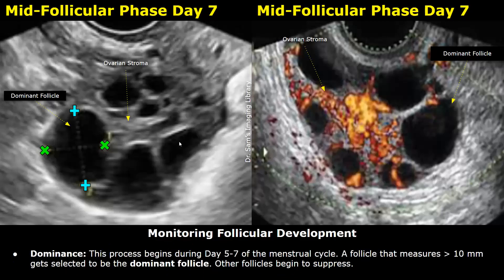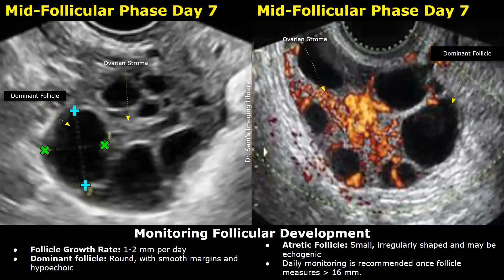During days five to seven, the process of dominance begins. At this stage, the follicle that measures greater than 10 millimeters gets selected to be the dominant follicle. You will start to notice one larger follicle — the one most likely to become dominant. However, sometimes a follicle that appears largest during days three to seven may not always become the dominant follicle, as another follicle can quickly start growing later on. At this stage, the growth rate is one to two millimeters per day.